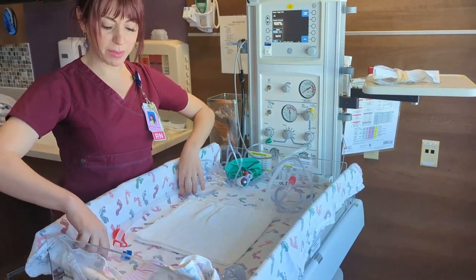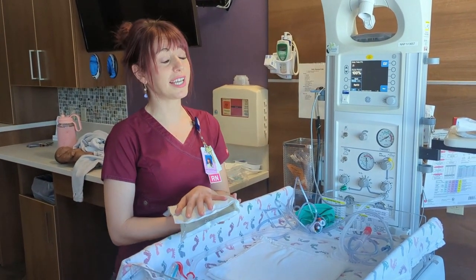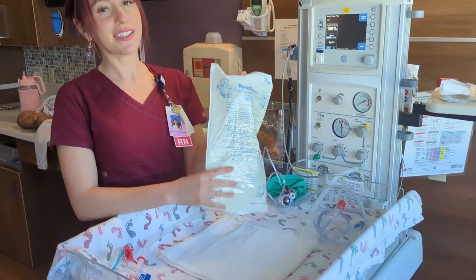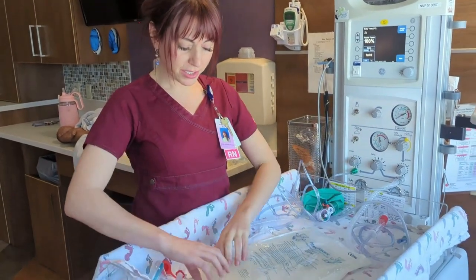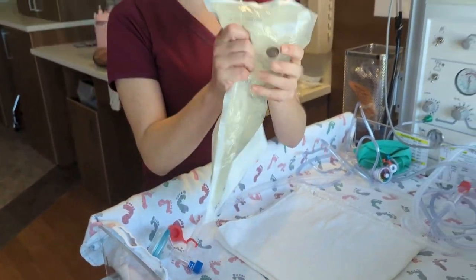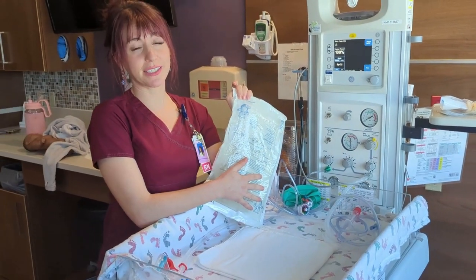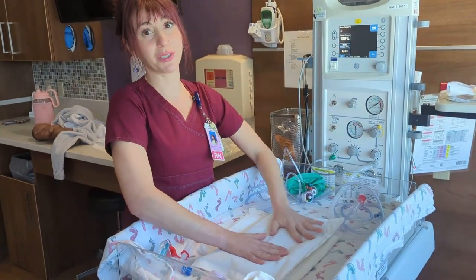For babies about to be delivered that are less than 32 weeks or less than 1500 grams, there are a few things we'll do differently. One is we'll use a chemical mattress. It's best to crack these open five minutes prior to delivery if possible. To use it, find the little disc, and crack it — that sets a catalyst effect that warms up the pack. Be sure to read the instructions to see which side should go up and if you need to cover it with a blanket. For this particular model, it's okay to place the baby directly on this side.